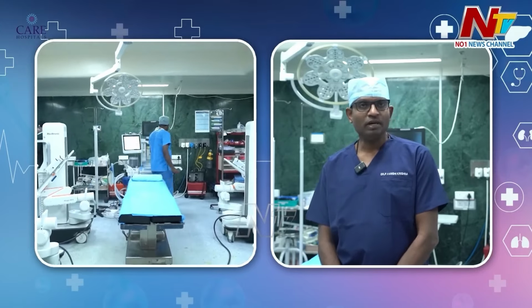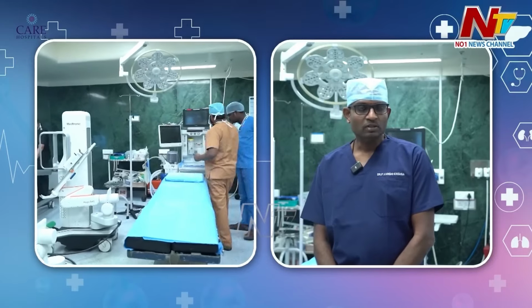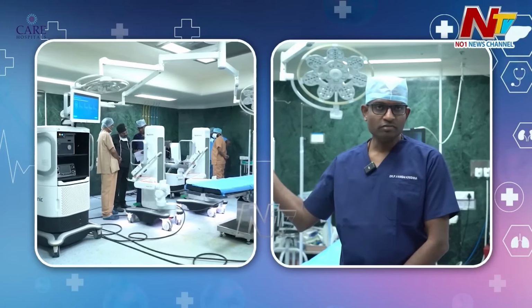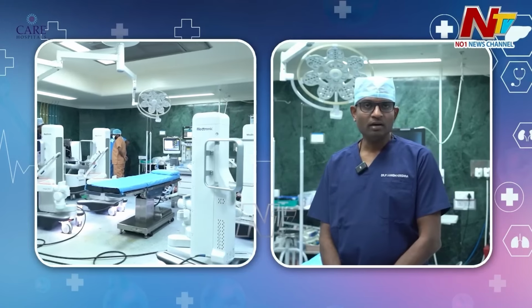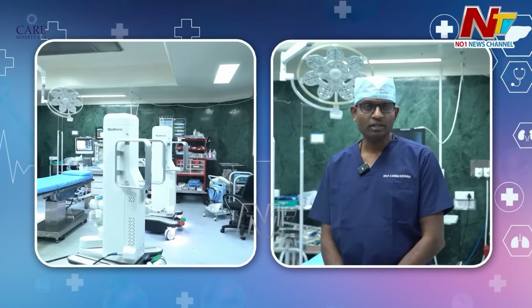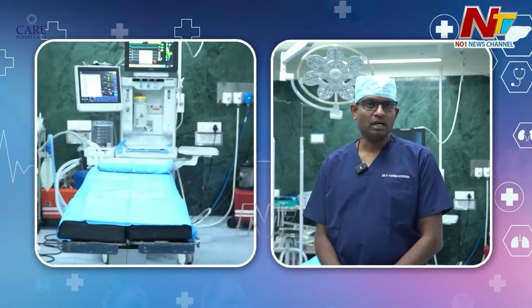So, to have a brief introduction, this is a master-slave robot. Here basically there are three parts. One is the surgeon console, where a surgeon sits and operates. Second is a vision cart, where all the camera, energy systems and the monitor are there for the assistant to watch. And third is a patient side cart.